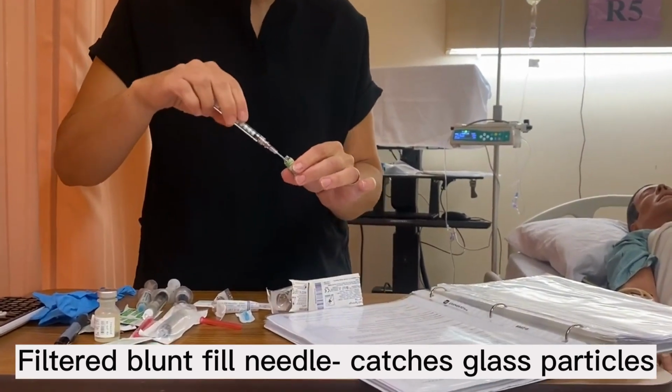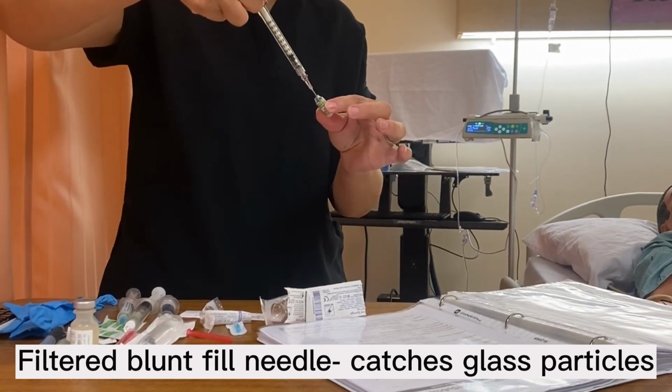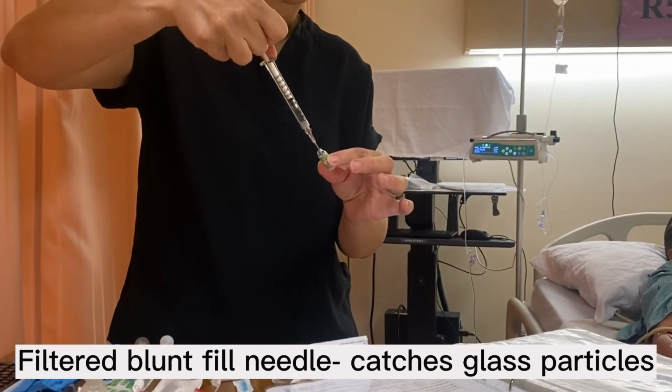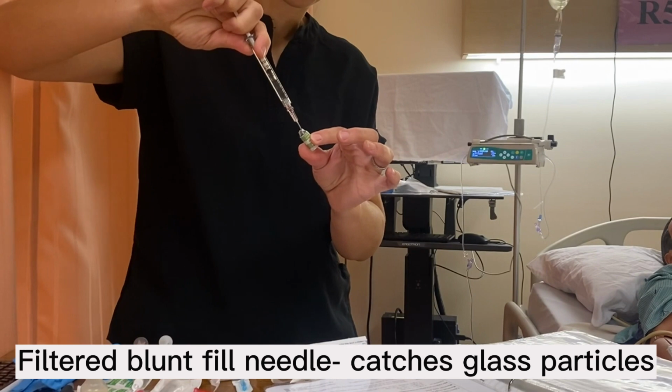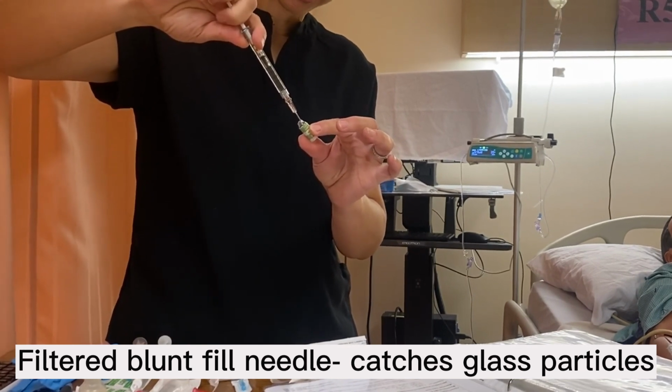Okay. And we don't need to instill air for an ampule. We're going to pull back. And normally in the clinical setting, you would crack the ampule. So I'm going to pull back. I have 0.5.